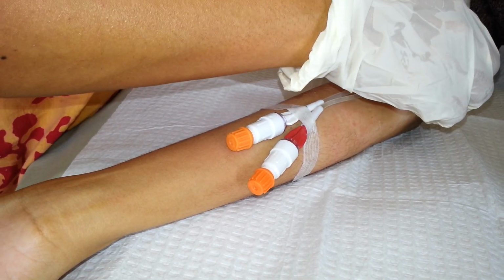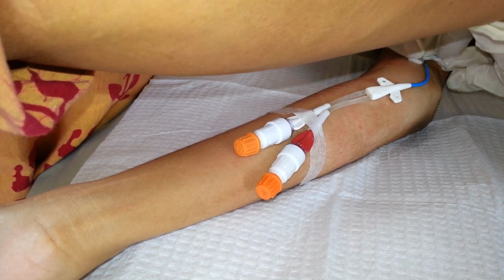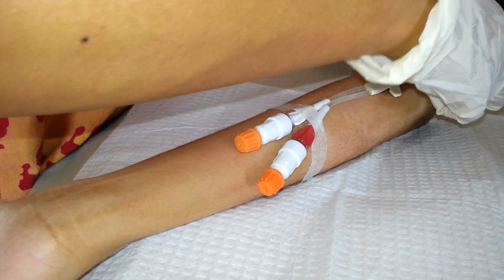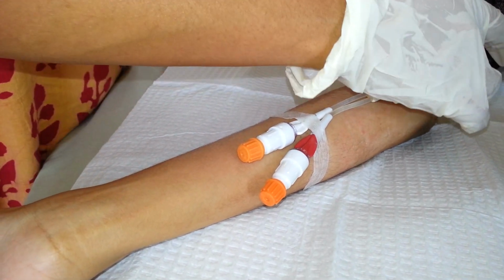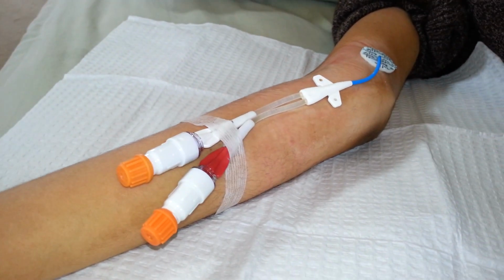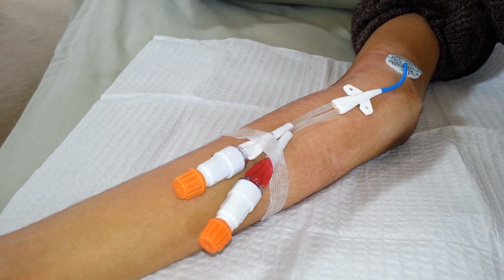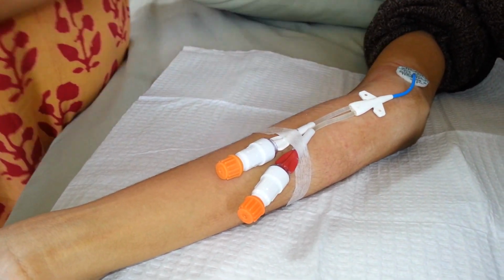This is extremely important because if we put the Biopatch at any other angle, it becomes really difficult to remove it when changing the dressing. And pulling on it can pull the catheter out as well. When it's aligned properly, it comes off easily. So please watch as we have done it.